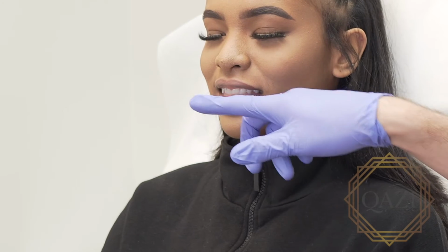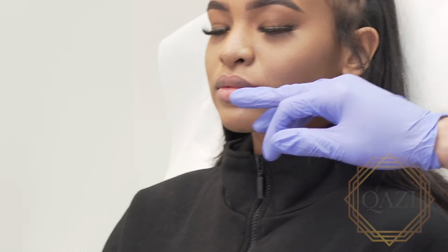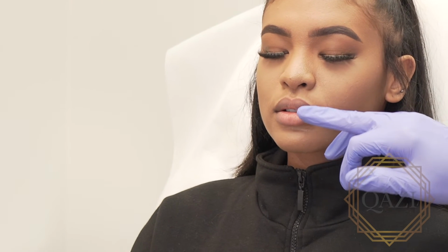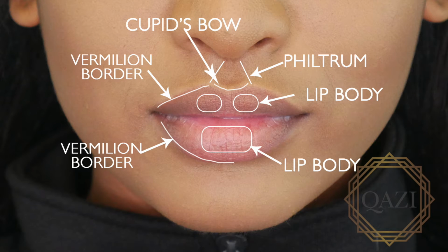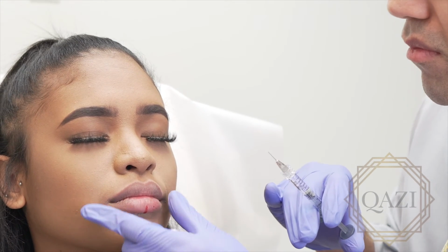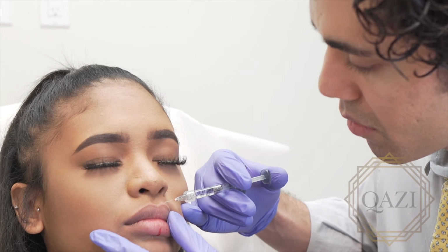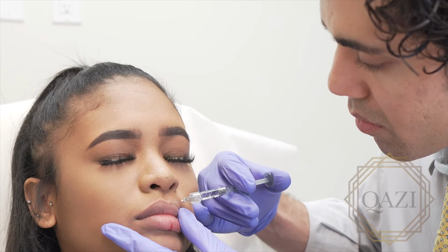So for this patient, she has a very nice lip shape. She has good volume already, but we could definitely enhance her vermilion border and cupid's bow and give a little bit of hydration and volume for the body of the lip. I always measure along the vermilion border to see where my insertion sites will be, and I do my injections in a retrograde manner.